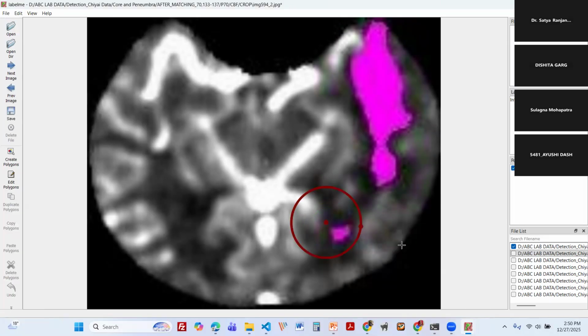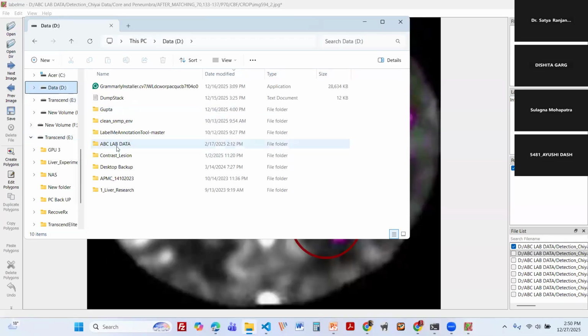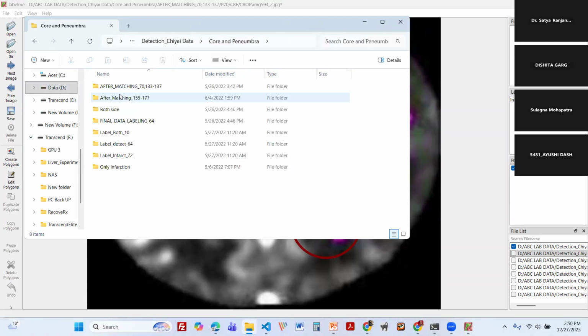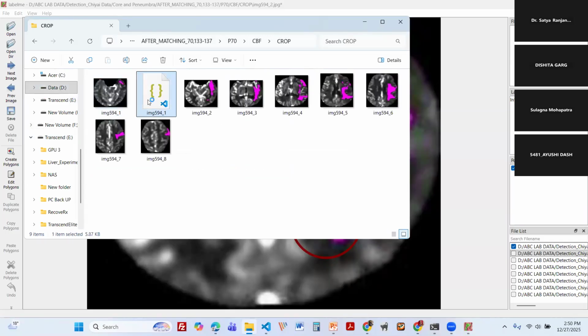Okay, just like you can give the label. So this one is for the segmentation. When we check what kind of label is already there, it actually gives us a JSON file.